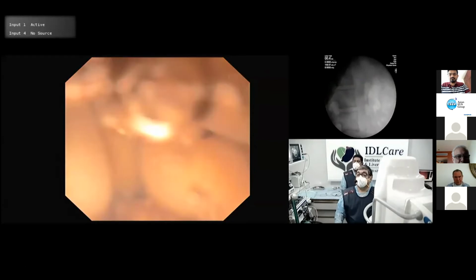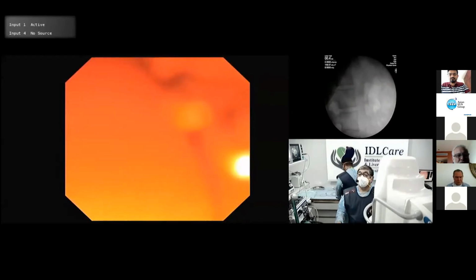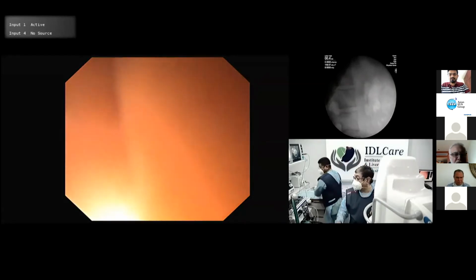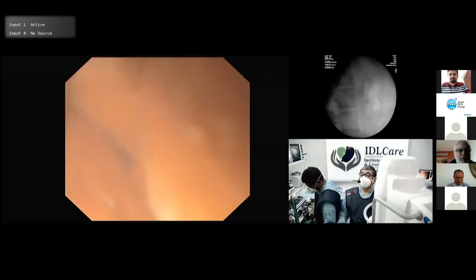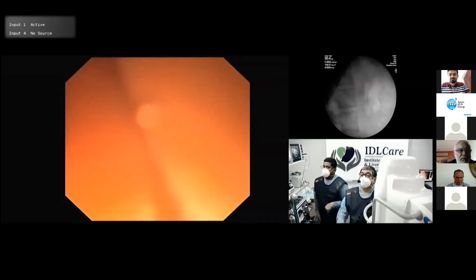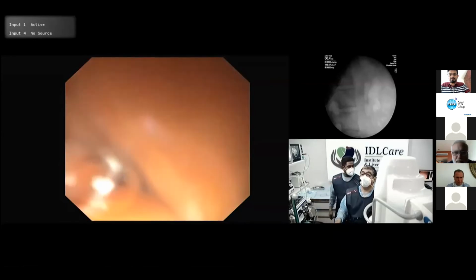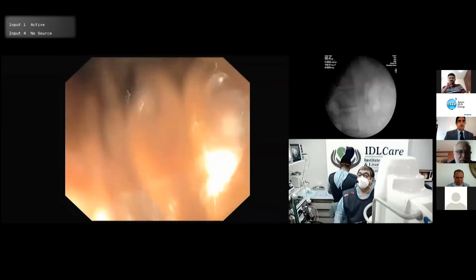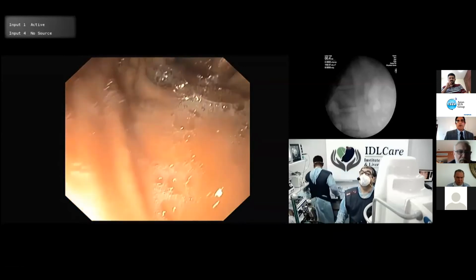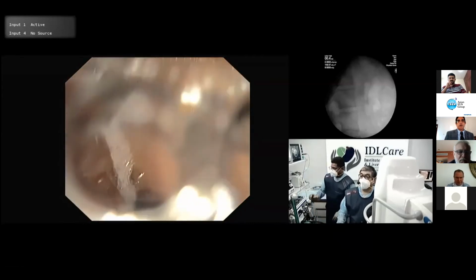So there is some residue in the stomach. I'll suck it out. She's a little unhappy. There is no air, give air. Yeah. So I am in the stomach. Here, she is hiccuping a little bit. Let me see that everything is okay. We'll suck out the air and then try to see if we can see the pancreas.